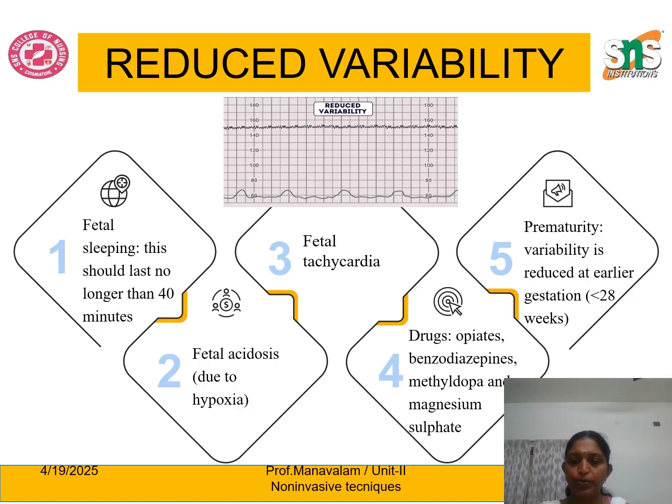It mainly depends upon the mother. So automatically it is not accommodating the changes happening inside the womb, and there is a variation in the fetal heart rate. Because of these reasons, there is reduced variability.